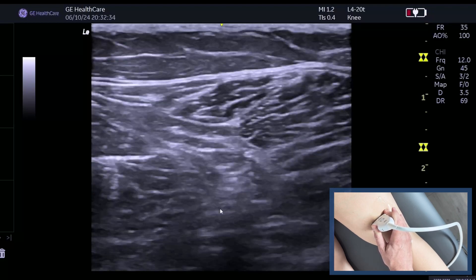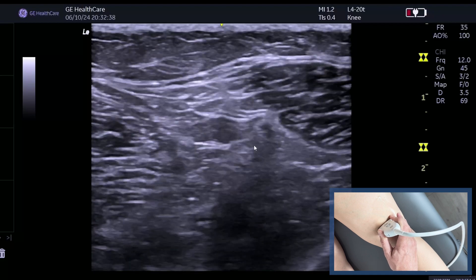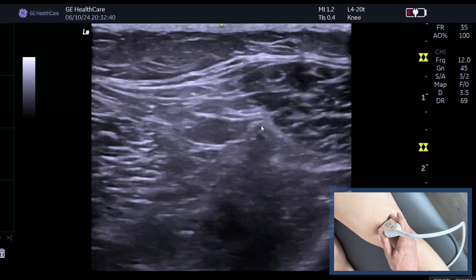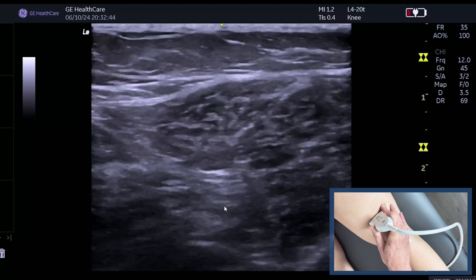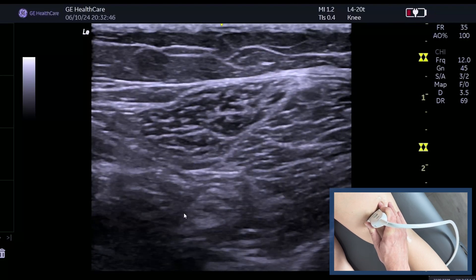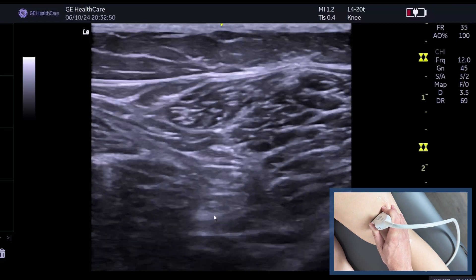So as we come down, we would expect it to split. Now can you see it's split already — that is the common peroneal nerve coming off, so you can see them together. Remember they sit in a fascial plane, and there you can see the sciatic nerve, and as we come off, that's the tibial.